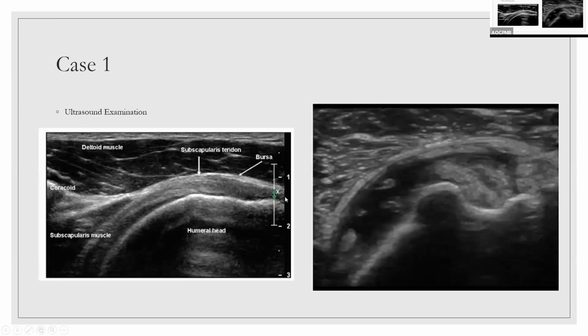So when I did his shoulder exam, I looked at the subscap. Remember, you start in the anterior view, and you have the long head of the biceps tendon, then you have the person externally rotate the arm, and you see the subscap coming around. This is what it's supposed to look like. This is what it looked like. Here's his long head of the biceps tendon. Here's some of it too. Actually, this is the long head of the biceps tendon. He completely pulled the transverse humeral ligament off the top. Here's the intertubercular groove. This is where the tendon's supposed to be, and only pieces of it are left.